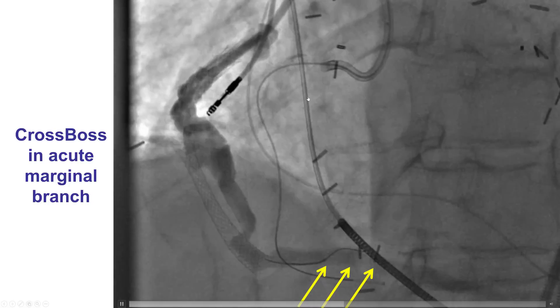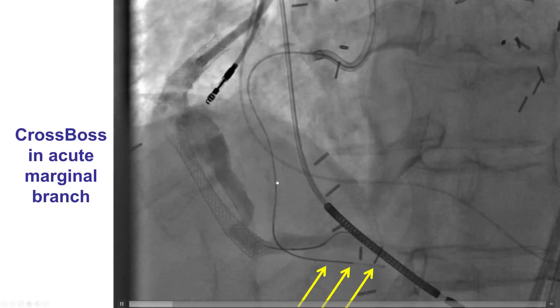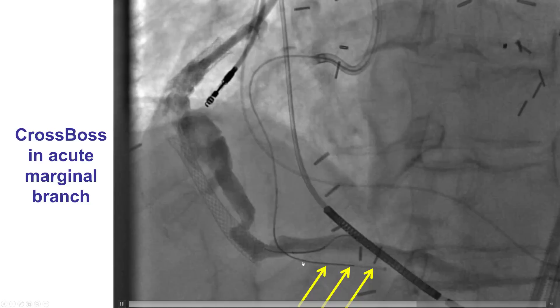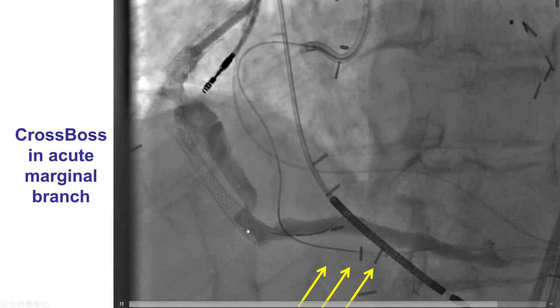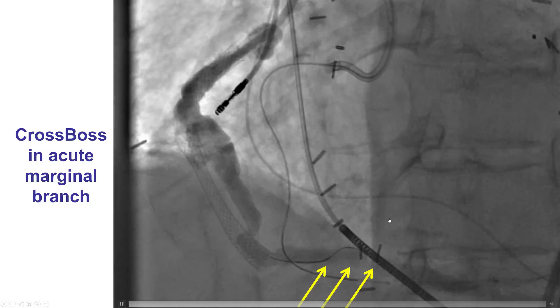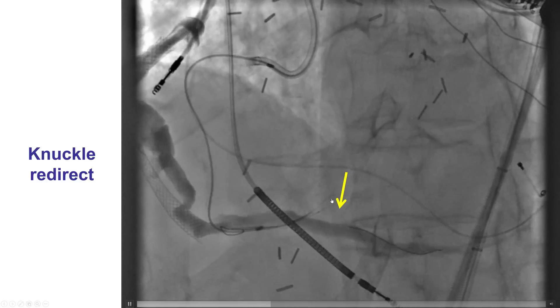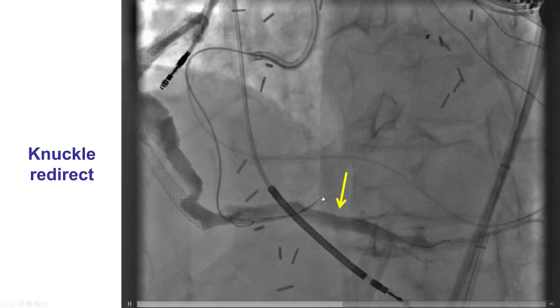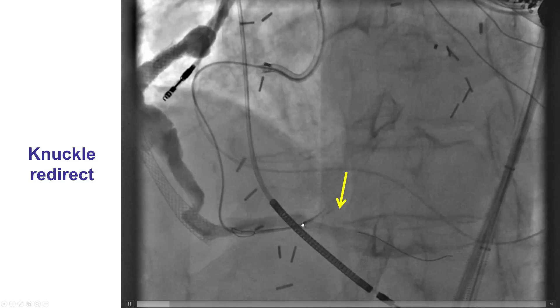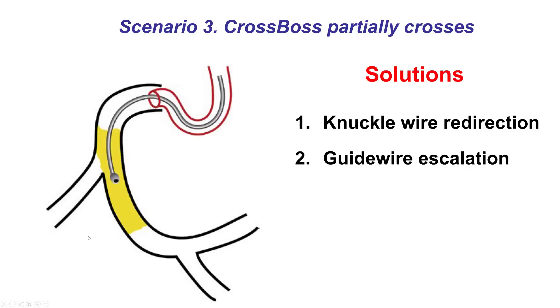This is an example of the CrossBoss catheter advanced into the right coronary artery and then going into one of the acute marginal branches instead of following into the distal RCA and the posterior lateral vessel. After using a knuckled guide wire, the CrossBoss can be redirected into the right posterior lateral branch.